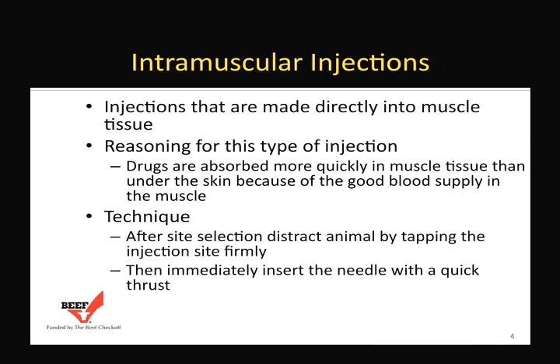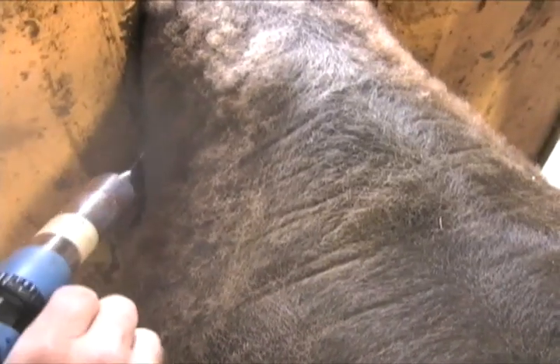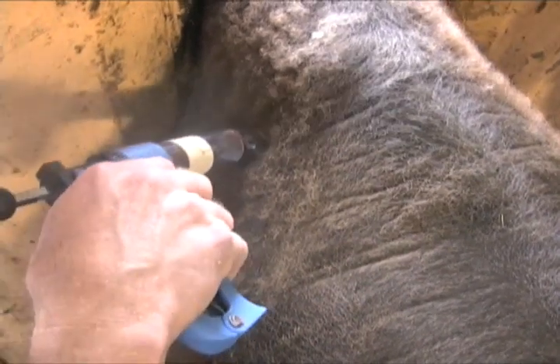Intramuscular injections go straight into the muscle. The reason for this is that muscle tissue has a higher metabolizable rate, so the antibiotic or vaccine is absorbed much more quickly. You can use one of two techniques for giving an IM injection. One is by distracting the animal by tapping on the neck and then giving the injection into the muscular region. The needle should enter the muscle nearly perpendicular to the neck, then dispense the product.